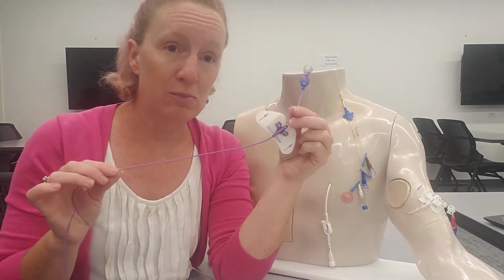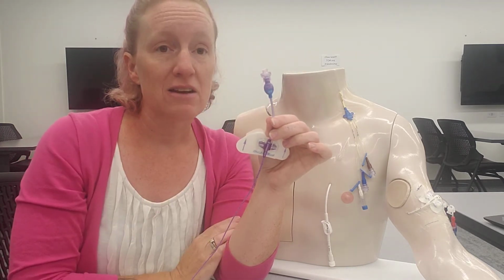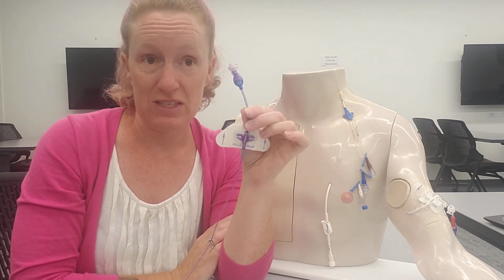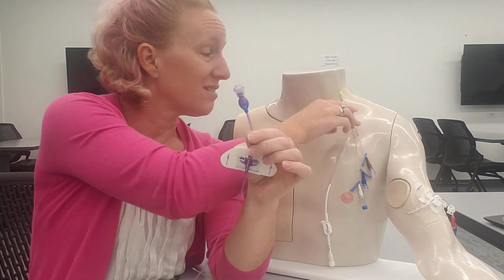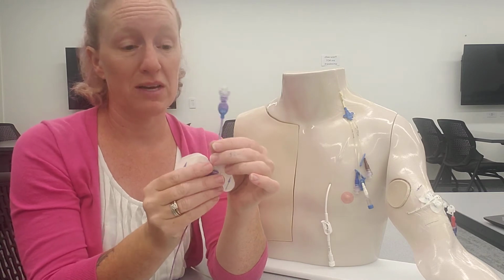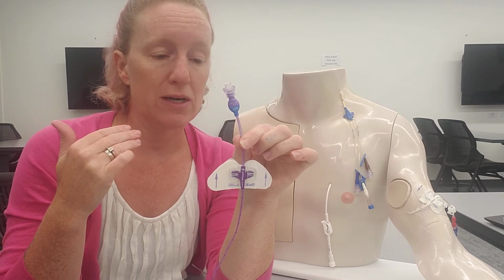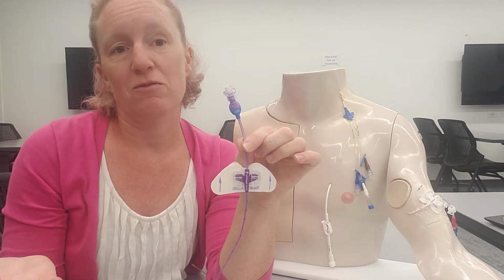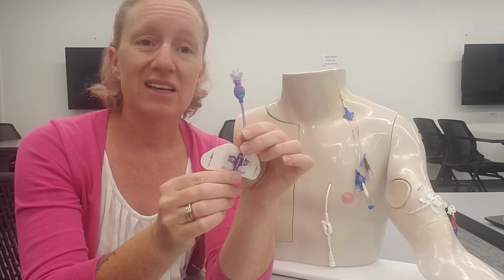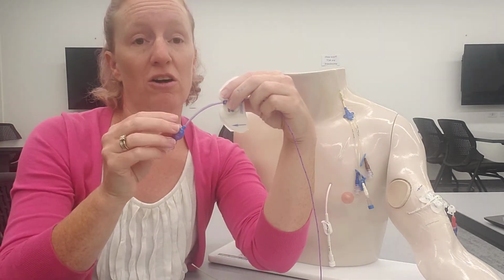That's why we're seeing a lot of PICC lines. And this is a single lumen PICC, which means it only has one port of access. For an ICU nurse or an ER nurse or anybody that's trying to do a lot of different medications, this is really dumb. All right, we want something that has significantly more lumens. We can give a lot more medications faster through that. But if you've got somebody who's on long-term antibiotics, or just needs TPN because they have hyperemesis or something like that, this will work perfectly for them at home and is a lot easier to manage than if they had like 3 lumens hanging off of it.